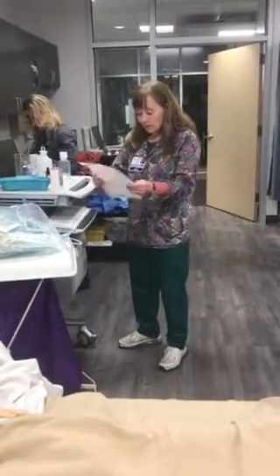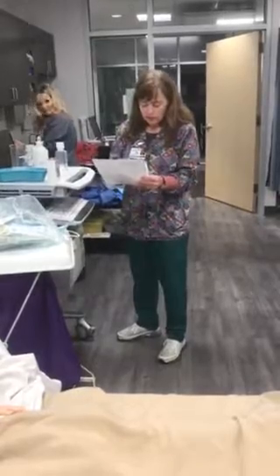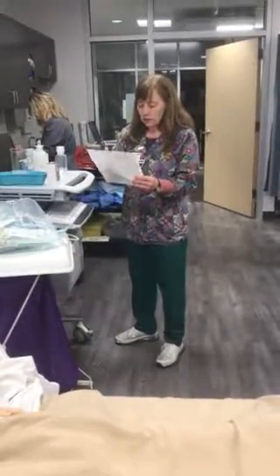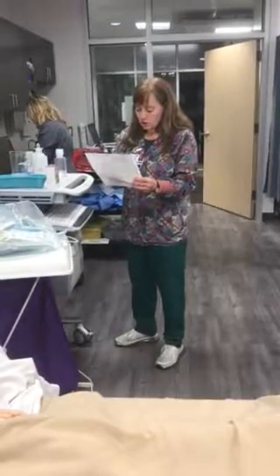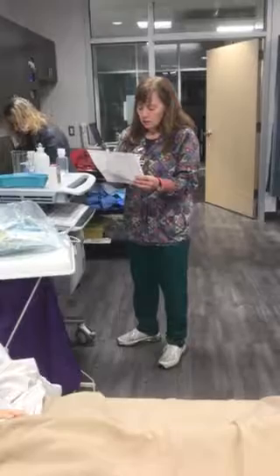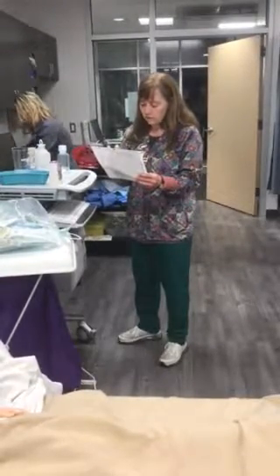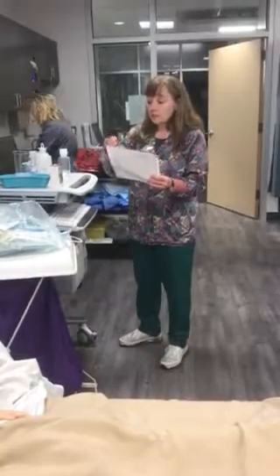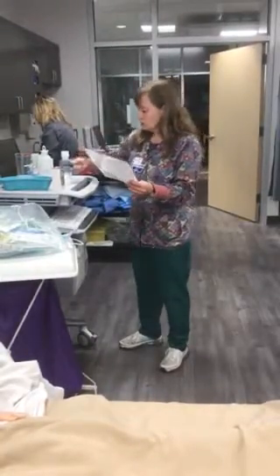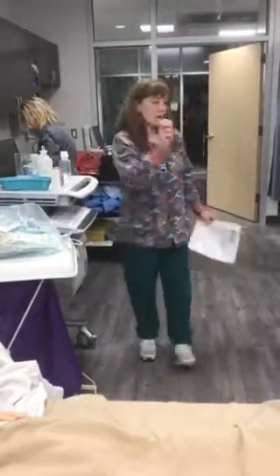So then the next thing we have is our erythromycin, right? So we have erythromycin liquid, 500 milligrams daily for metatarsal, 6/21/88, no known allergies. Metatarsal, date of birth 6/21/1988. This is 500 milligrams per milliliter, expiration date 6/20/25. So this is not expired. It looks pretty intact. I'm not noticing anything funny. It's kind of hard to see through this. It's a dark bottle. So then, how much do I need to take out of here?